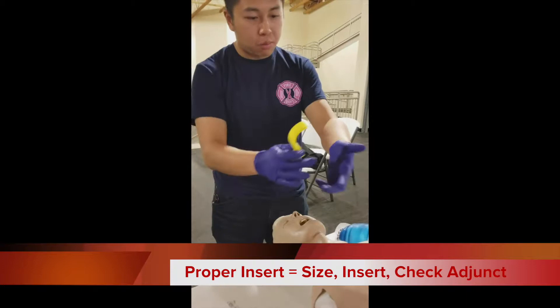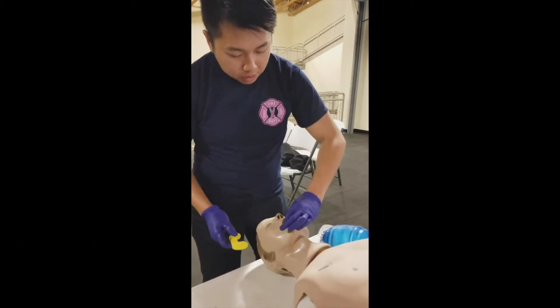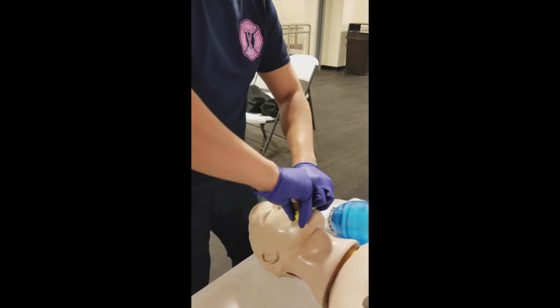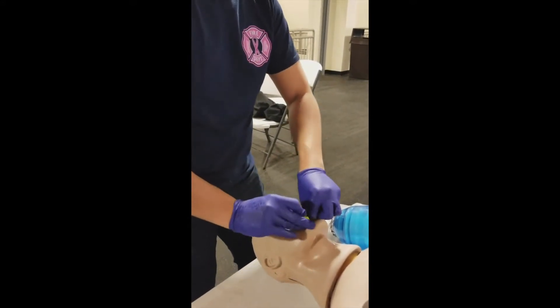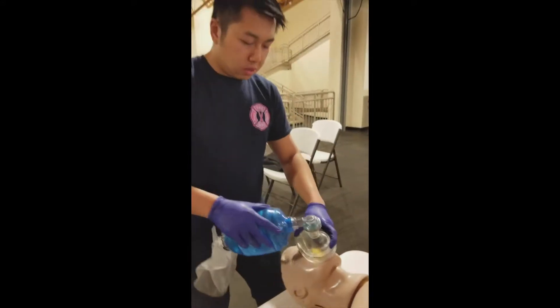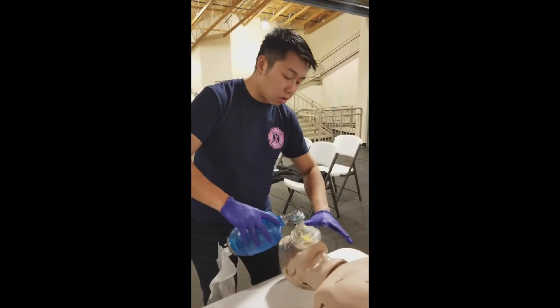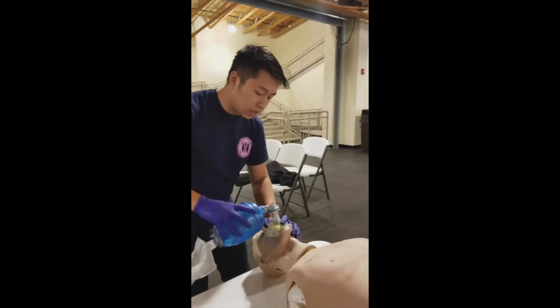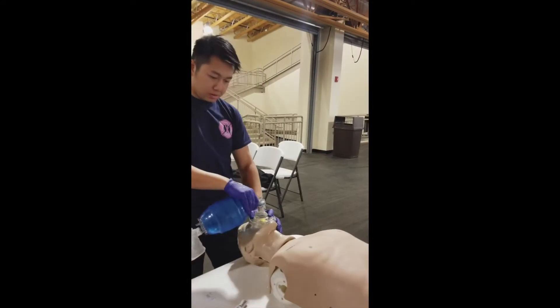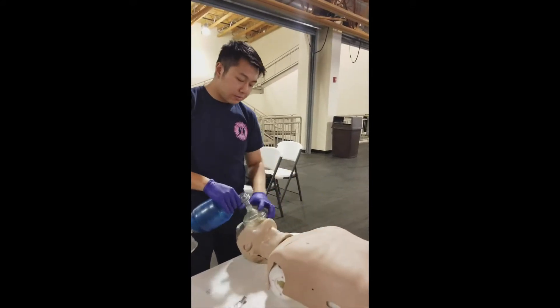To insert it, you're going to crisscross your pointer finger and your thumb to open the airway up. For an adult patient, you're going to insert towards the hard palate and rotate in, pushing in as you do so. Once you get that secured, you can ventilate your patient — create your claw and your C and do a head tilt chin lift. Now you can deliver ventilation to your patient, and you should see chest rise and fall.